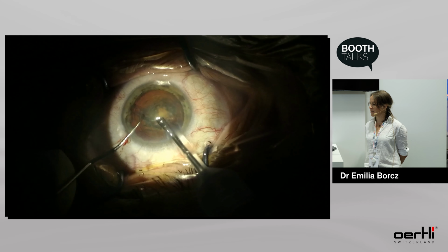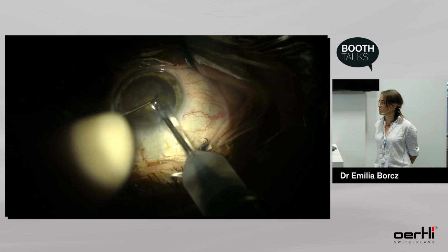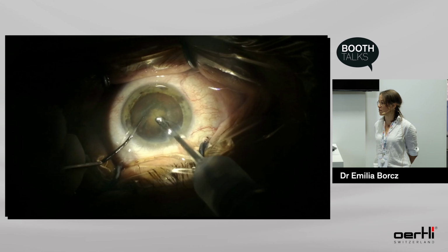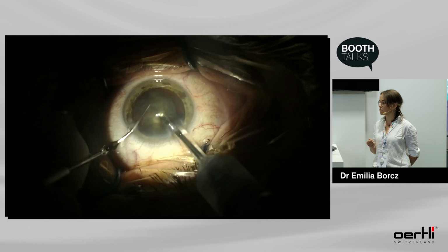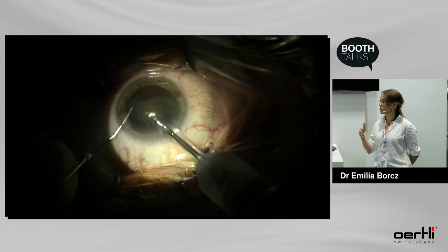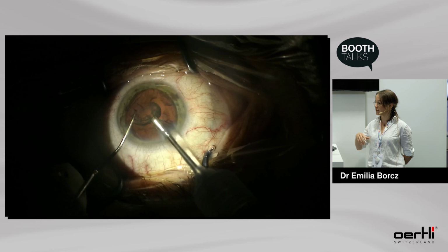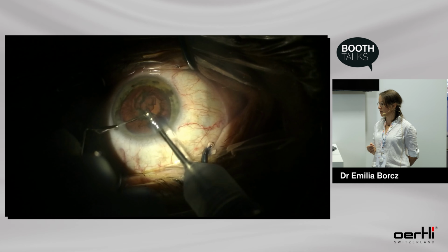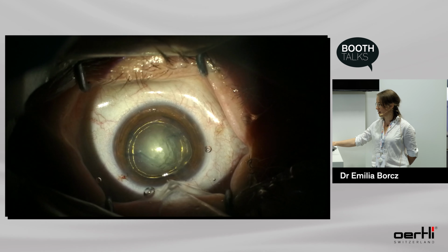Here, bubbles always, or sometimes, come into the anterior chamber. Okay, so pre-phaco, and I try to perform phaco chop, but it's very difficult because it's very soft. So I go more to the center and I take up the nucleus, like a lollipop technique. And the rest of the material, which is very soft, is removed very fast, in a few seconds, as you see. All the time I hold the bevel down, so it's easier for the lens to enter the opening. The anterior chamber is still stable, even though not many fragments are left.